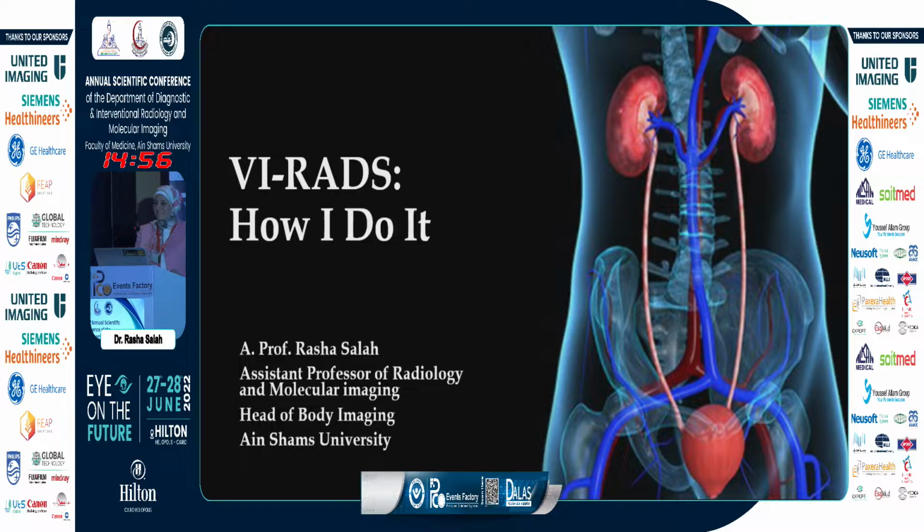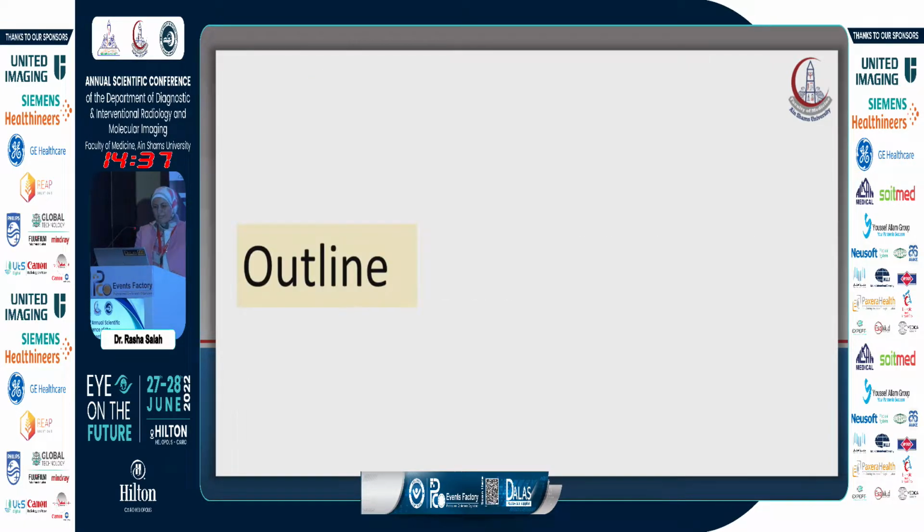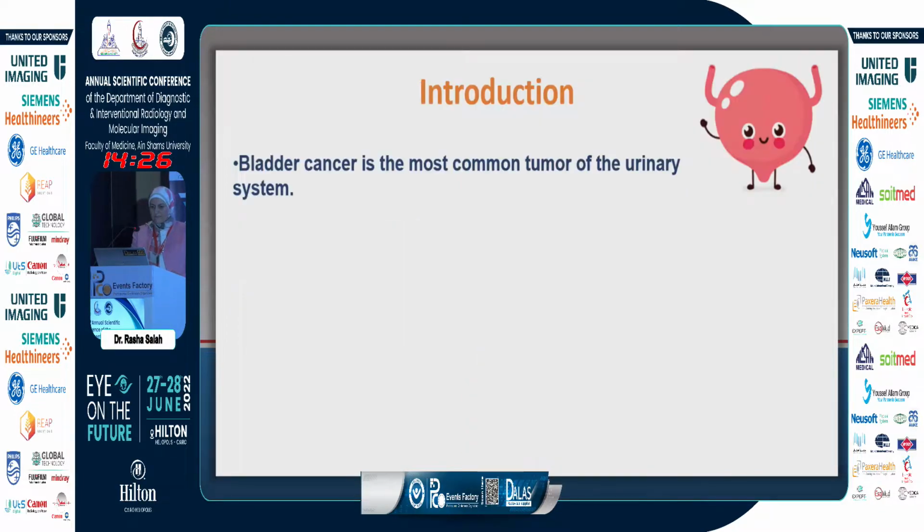Today we will discuss a new imaging category, which is the VI-RADS, and how we do it. This is my acknowledgement for my dear younger colleague, Shohinda. I was her supervisor in her thesis, and all our cases were performed in Ain Shams University Hospital. We will talk about some introduction about the bladder cancer and the VI-RADS scoring and how we do it, and we will present some cases.